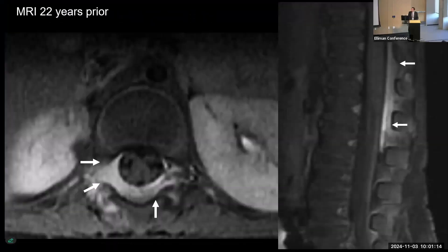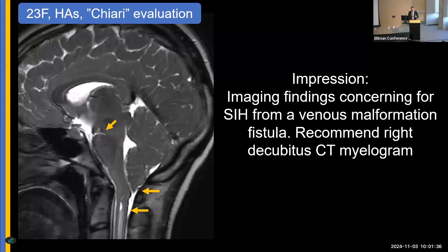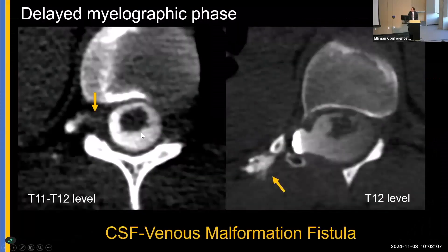Even more interesting: an MRI from 22 years prior, when she was one year old, showed an epidural enhancing lesion read as an epidural hematoma or hemangioma. The patient had lived normally until the past few months. I wondered if we were dealing with a vascular malformation fistulizing with the CSF and suggested a right-sided decubitus myelogram. Working with colleague Bill Dillon at UCSF, the myelogram again showed bizarre dural ectasia. A phlebolith confirmed a venous malformation. On delayed scan, abnormal communication with the subarachnoid space confirmed a CSF-to-venous malformation fistula.